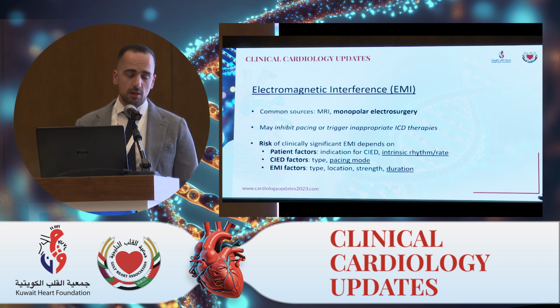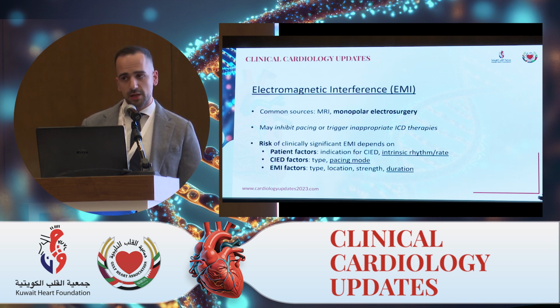And this risk depends on many factors. It will depend on patient factors, such as why does the patient have a device? What's his intrinsic rhythm or rate? It will also depend on the device itself. What's the pacing mode? And most importantly, it depends on the source of electromagnetic interference. What is the location? What is the strength? What is the duration? The reason I bring up all these factors is just to highlight how it is not as simple as turning off a switch. Any patient who has a device undergoing a procedure or MRI needs to be properly assessed to determine what the best route is based on whether or not EMI is a risk.